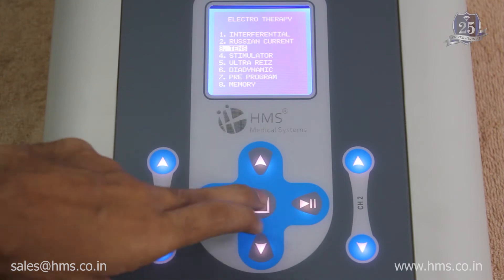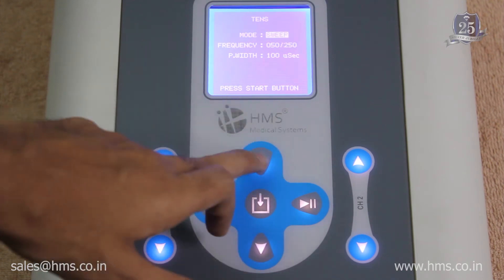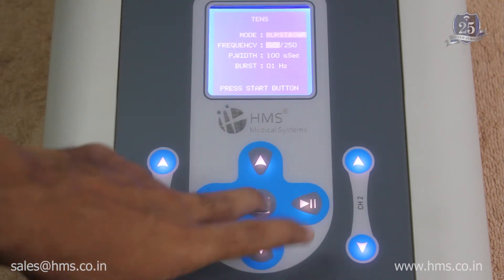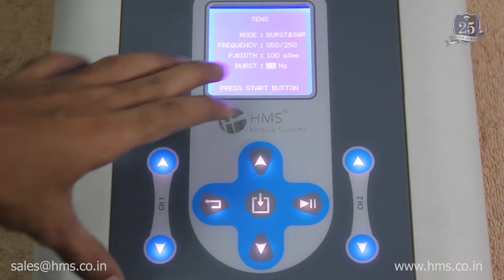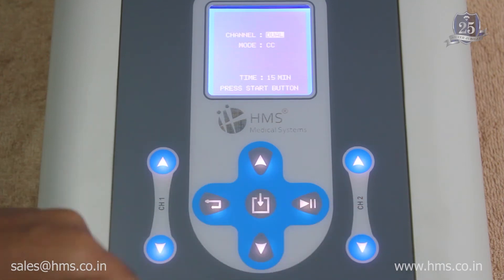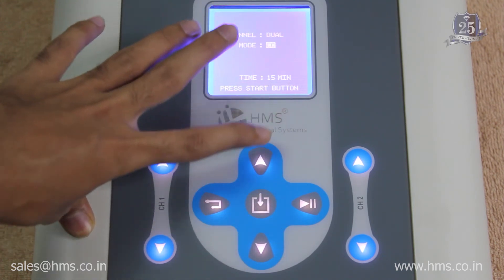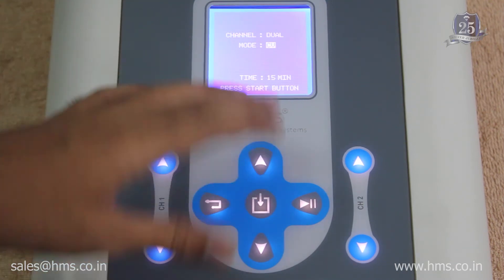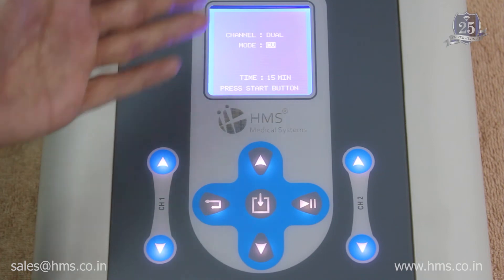Next is TENS, which has four different modes: continuous, sweep, burst, and burst and sweep. Frequencies, pulse width, and burst frequency can all be set according to your needs. When starting treatment, you have two output modes: CC (constant current) and CV (constant voltage), which control the output delivered through the electrode to the patient. CC is most commonly used, but CV is also available.